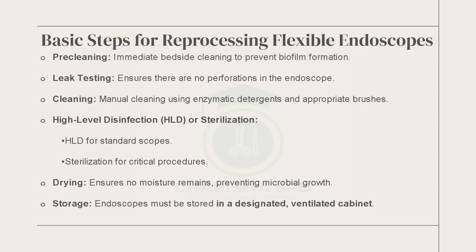And then when you do the leak test, the testing device will be there. When you leak test it and it fails, you still have to go ahead and clean it, even though it failed. But it has to be communicated to the clean side when you are in decontam that the scope failed a leak test, therefore it should not be processed to be used the next time.